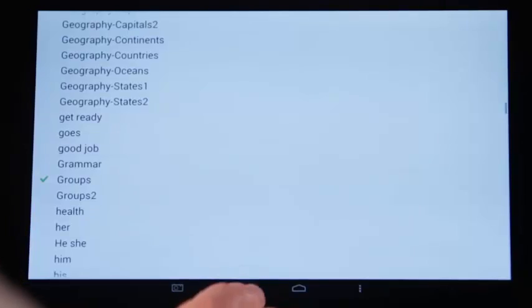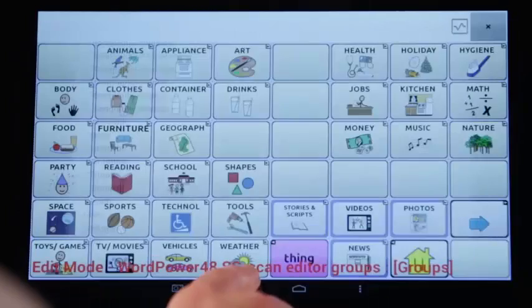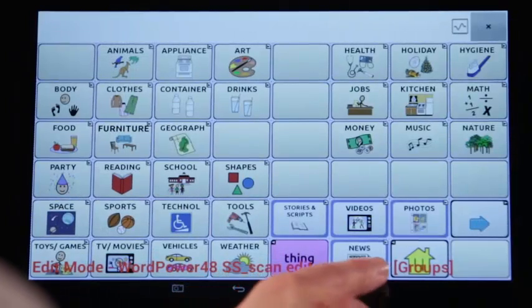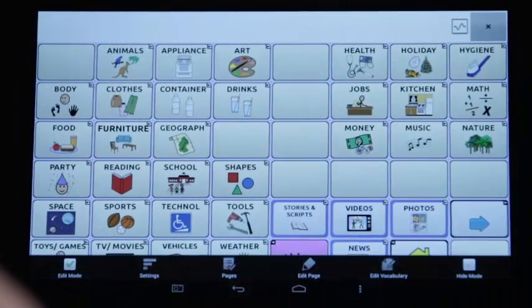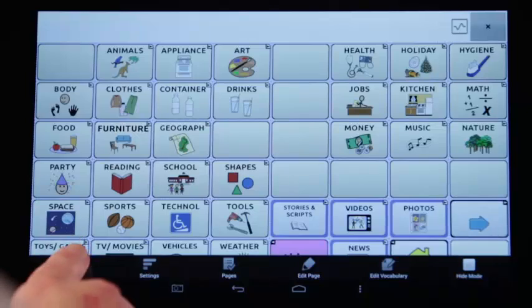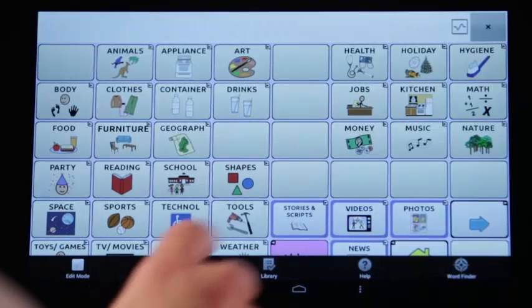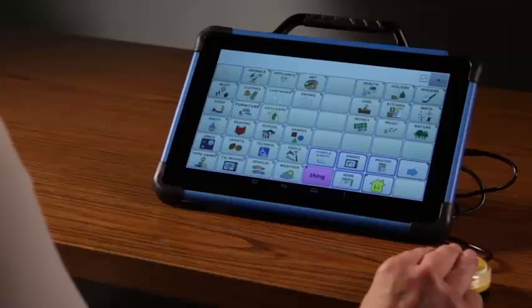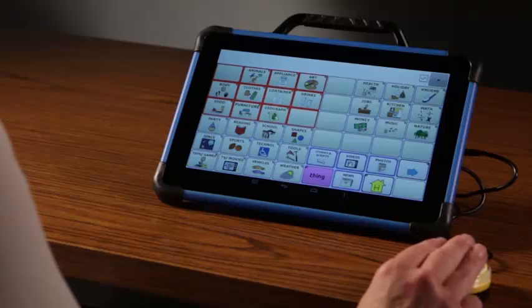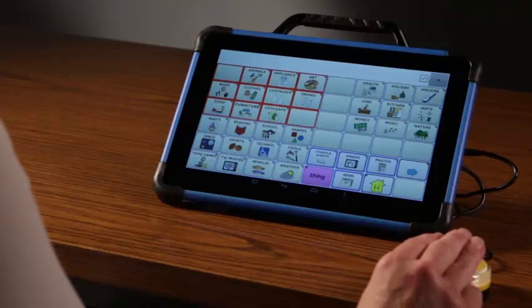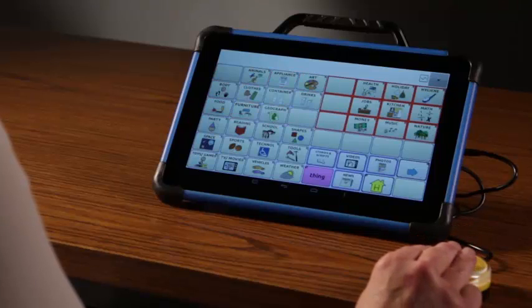Arrow back to the vocabulary. Tap Menu and Edit Mode to exit Edit. Let's take a look at how the scan pattern and auditory prompts work.